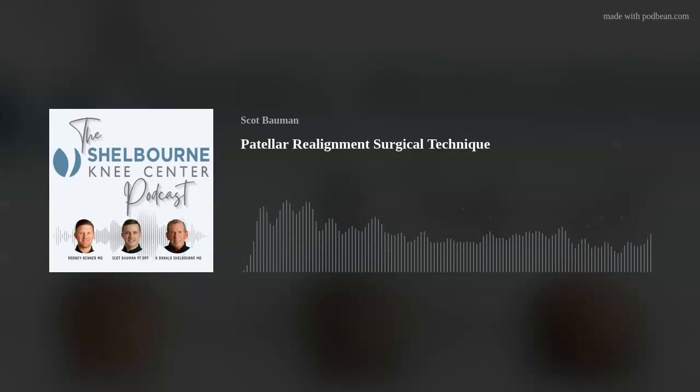You can really put that tibial tubercle wherever you want to put it, and that's good and bad news. You do have pretty good leeway on what to do with the tubercle, but sometimes it's difficult to know exactly how far to move it one direction or the other. The medialization portion is a little bit of a feel, and it's actually a little bit more medialization at the top of the osteotomy than the bottom. That's one technical pearl: it's really the top of the osteotomy, where the tibial tubercle has the attachment to the patella tendon, that we need to medialize even more than the distal portion. So you can tip it a little bit and medialize the proximal portion, but not the distal portion.